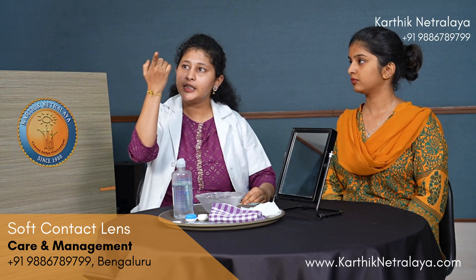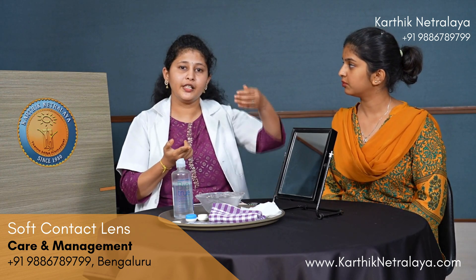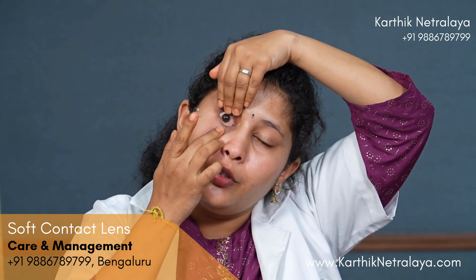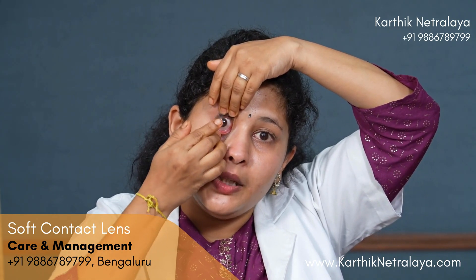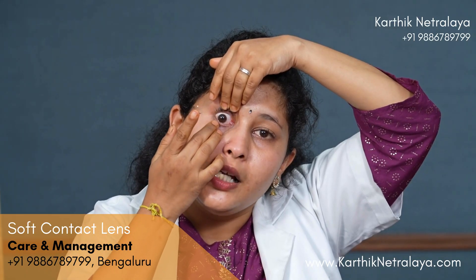I am checking the lens now — it is in the right direction. To wear the contact lens, from the opposite hand pull the upper lashes and with the middle finger of the right hand pull the lower lid down, pressing it like a button. Open the lid as much as possible because the diameter of the lens is bigger than your lid size. Press it in place, then slowly release your lower hand.